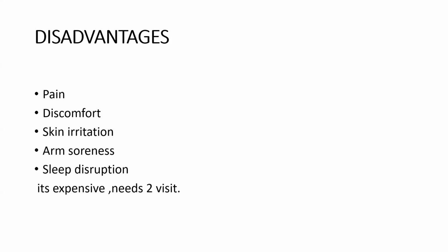I heard you talk about issues with disturbing the sleep of the patient. I've had experience with a patient who had this ambulatory blood pressure monitor, and the patient reacted to the cuff. Sorry, Chief, I didn't hear you. I said I've had an experience, in terms of complications, where when you put the cuff on some patients, they could react to it.